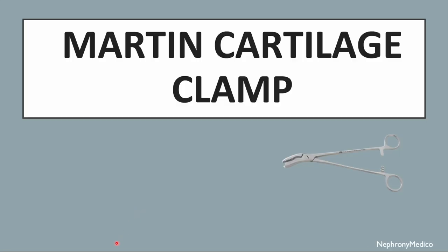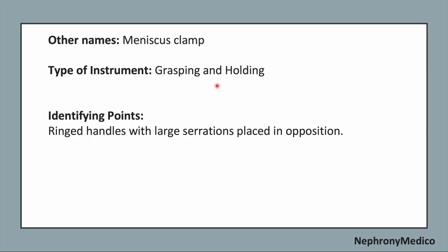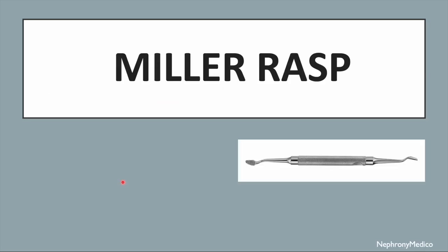Let's talk about Martin cartilage clamp. This is a picture showing Martin cartilage clamp. The other name of this instrument is meniscus clamp. It is a grasping and holding type of instrument. Now, identifying points. Ringed handles with large serrations placed in opposition. Use. It is used for grasping heavy tissues and cartilage. The Martin clamp is often used to grasp the meniscus for dissection during total knee arthroplasty.